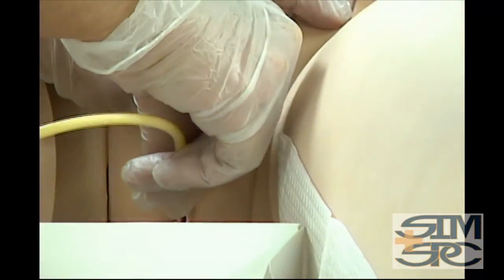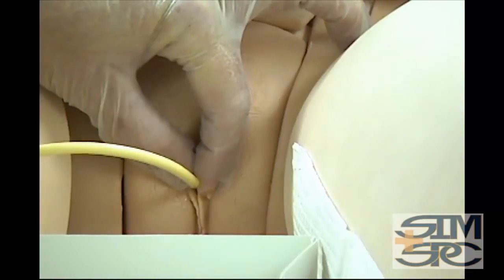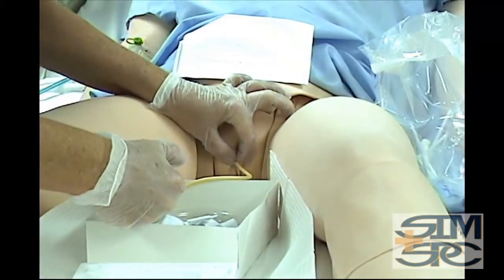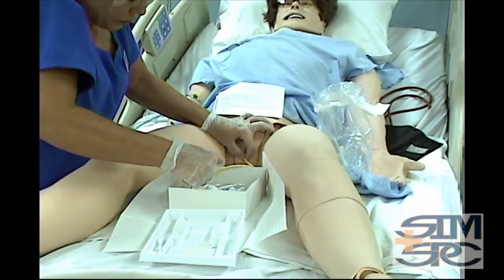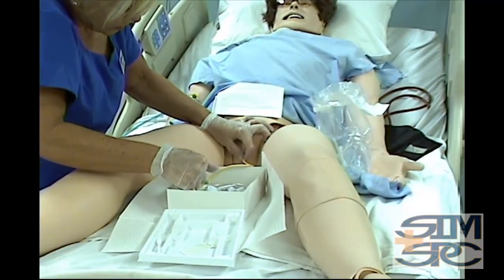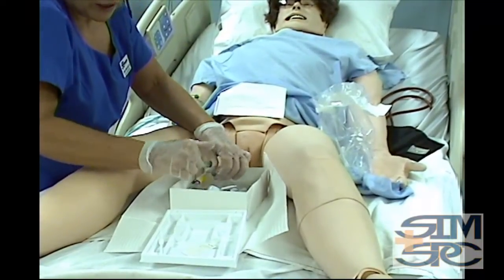And once you get about 2 to 3 inches in, make sure you don't touch the Foley. Once you get 2 to 3 inches in, you should see urine. If you do, go another inch, hold it. You're going to place the fluid. Okay. Once you've got the fluid placed, you're going to give a gentle tug. Just a little gentle tug. Once you've done that, then you can release and come down and disconnect.